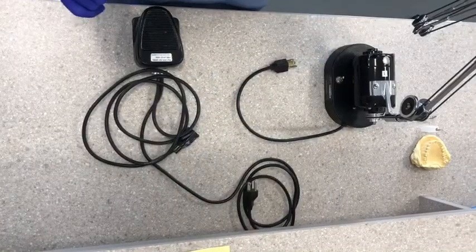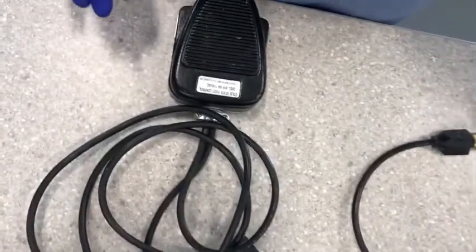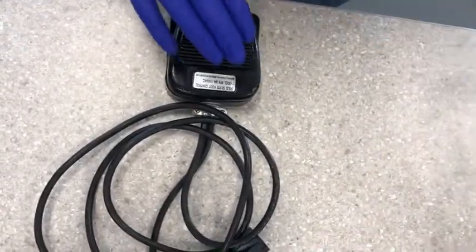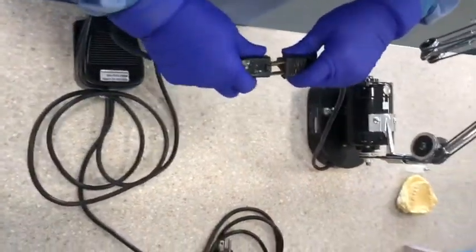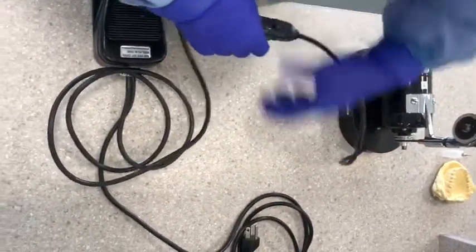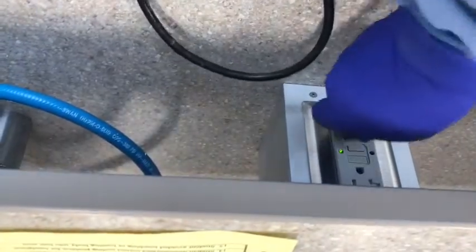Okay, we're gonna show you how to plug in the rheostat to the lab engine handpiece. You do want to attach the handpiece to the cord for the rheostat first, and then you will plug in the end from the rheostat to the outlet itself second. So in that order, and then you'll put your rheostat down on the ground here.